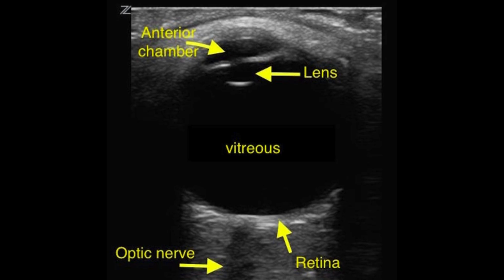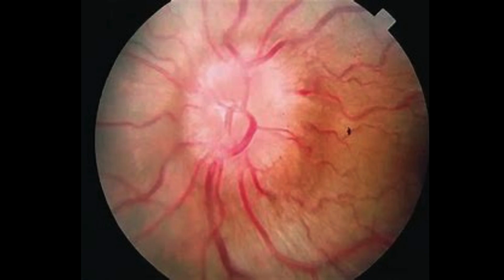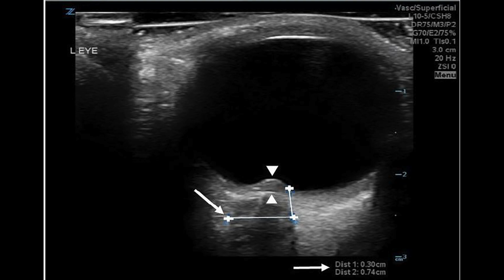Okay, but this is the retinal detachment. And then papilledema, this is more for the physicians. I think we're not really going to look for papilledema, but look, I don't know when last you looked into the eye. I don't know, Bianca. Maybe it's just me. So ultrasound, you can see the papilledema. Right, so there's also retinal detachment. You can see the retina moving around in the eye.